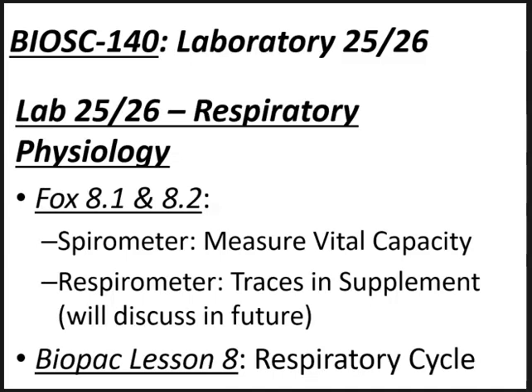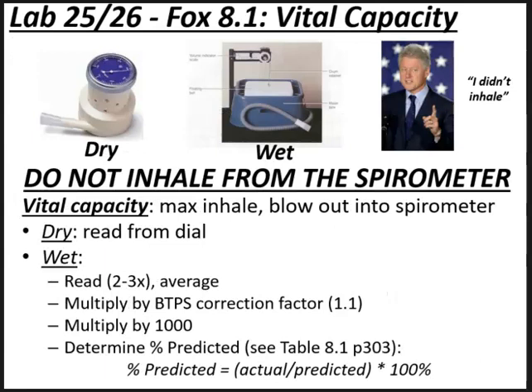So these are experiments 8.1 and 8.2, and then we will look at how to do calculations for the respiratory tracings. The spirometer was made for exhalation only, and only to measure expiratory volumes. We can actually obtain volumes of inhalation indirectly by calculating them.